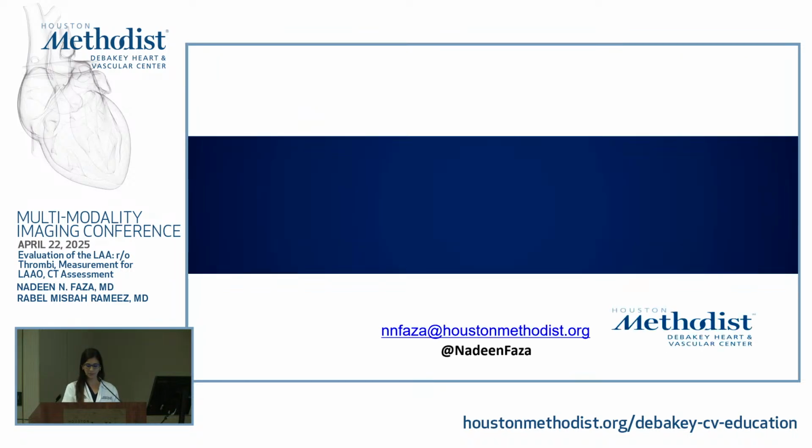Turn it over to Dr. Rameez, who will discuss CT imaging of the appendage.